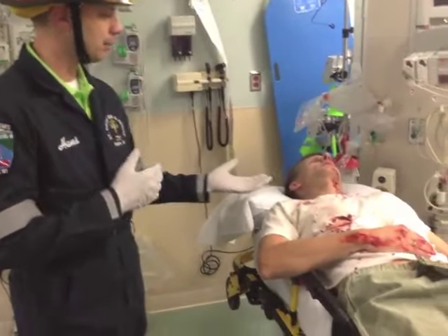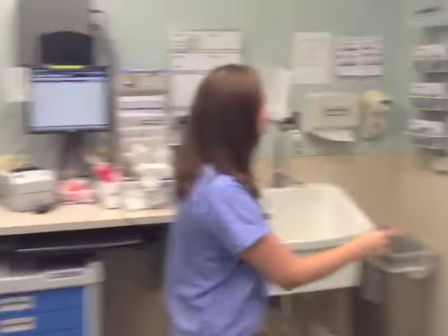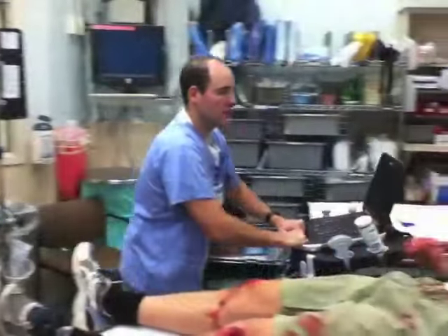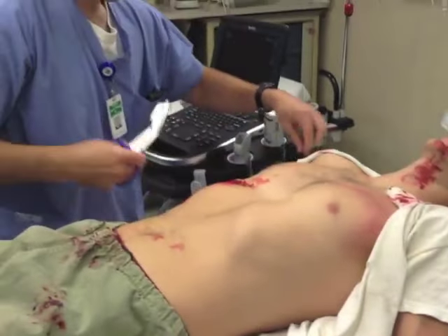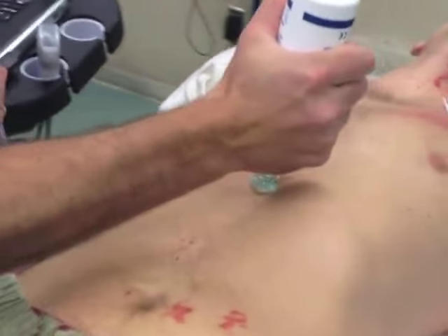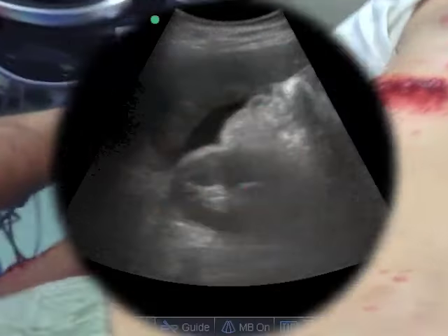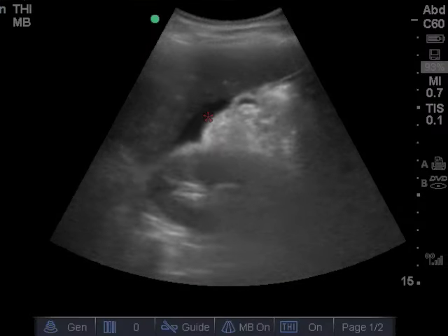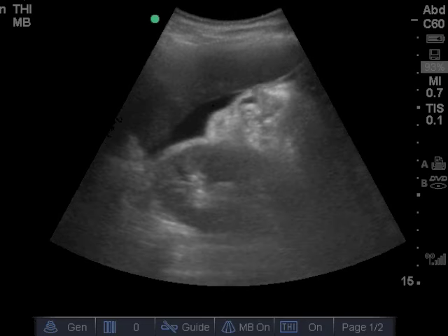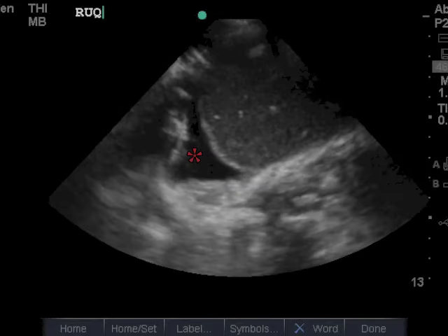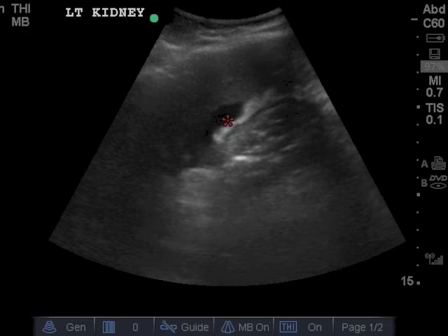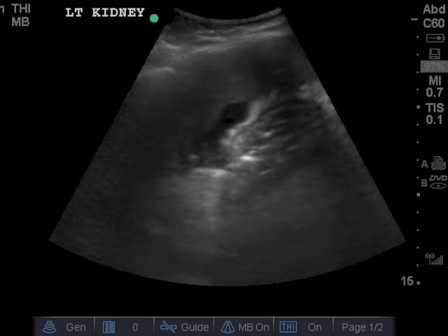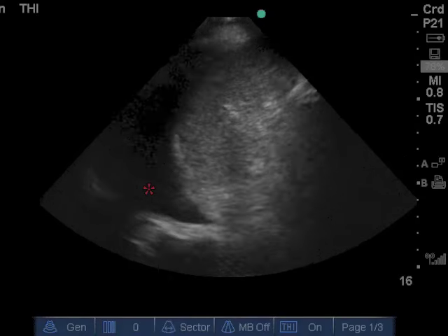Bad place happened up in front of the hospital. We need the IV, O2, monitor going. Can you come in here and do an ultrasound? Sure. Start with the gel in the epigastrum. First to the right upper quadrant — black stripe, free fluid in Morrison's pouch between the liver and the kidney. Moving above the diaphragm, we see the same thing: dark black fluid — that's a hemothorax. Now onto the left upper quadrant. That's a black fluid stripe in the splenorenal recess between the spleen and the kidney. And again, fluid above the diaphragm — more evidence of a hemothorax.